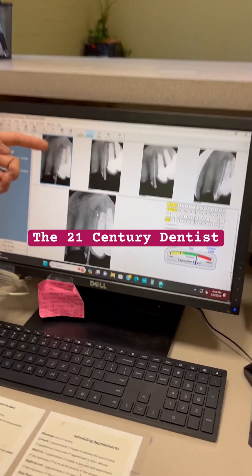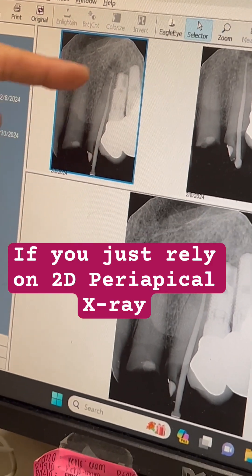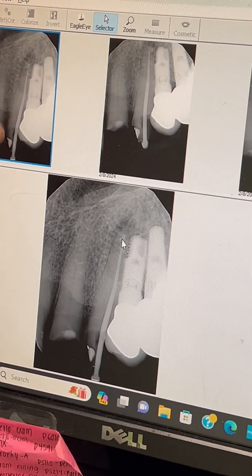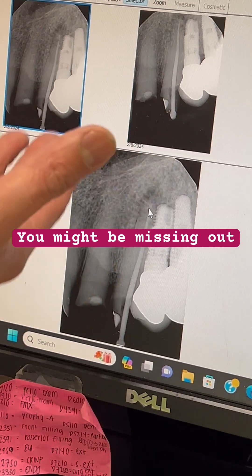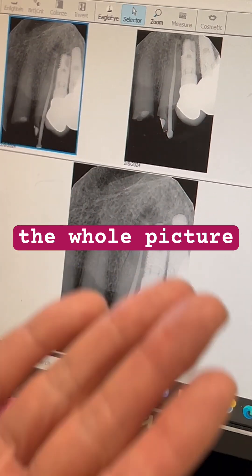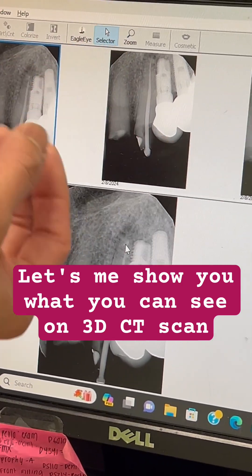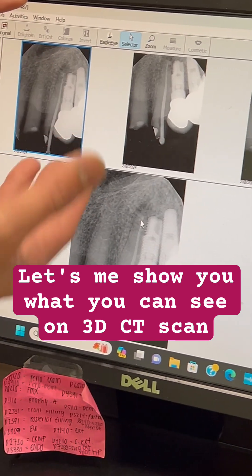Here is the X-ray of number 11 — PA. All I see is just a very blurry radiolucency, but it's not very clear. If my gutta-percha is in there, I'm ready to feel good. But what happens if I have a little bit of extension of the gutta-percha outside the apex? Then that's not good.